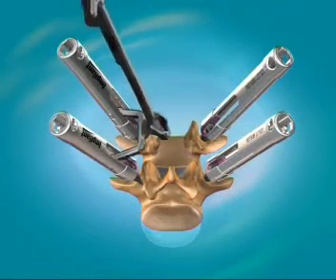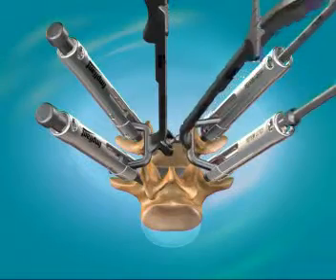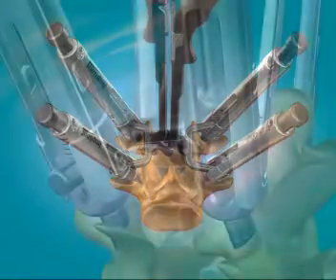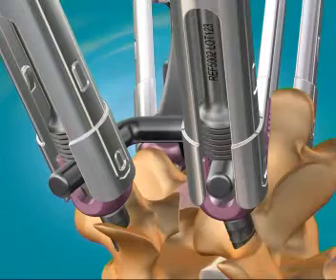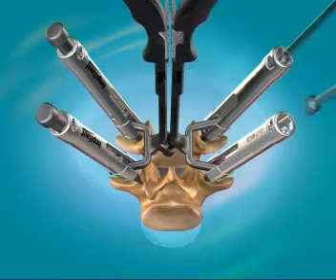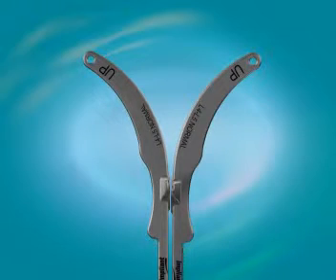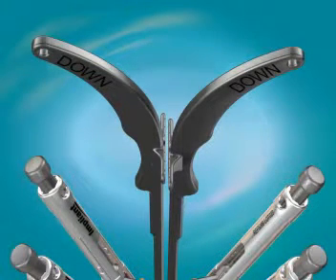Gauges are provided to determine the proper implant type, either normal or low profile, that will match the patient's anatomy. Select the appropriate gauge, regular or low profile, that will sit firmly within the saddle of the pedicle screw heads. In addition, the gauge serves as a tool to align the heads of the 4 pedicle screws on the same plane. Be sure to take the gauge that corresponds to the proper segment, for instance, L4 to L5, and the proper implant type, for instance, low profile.